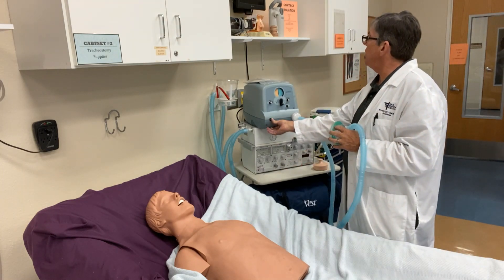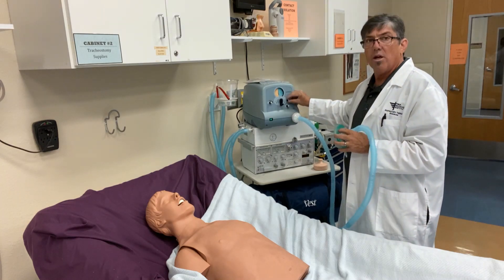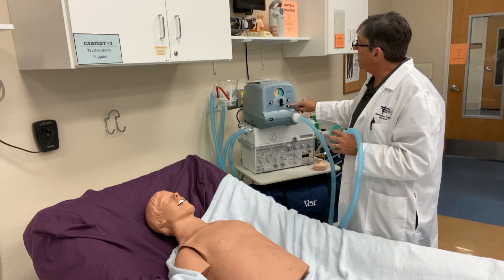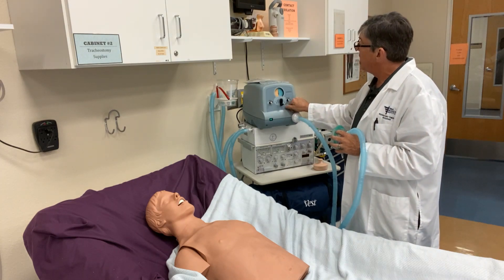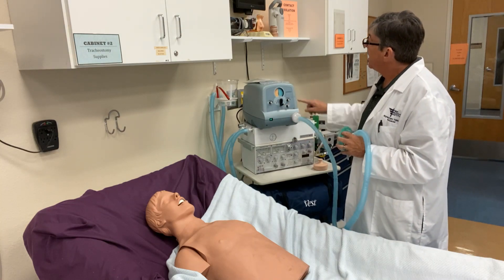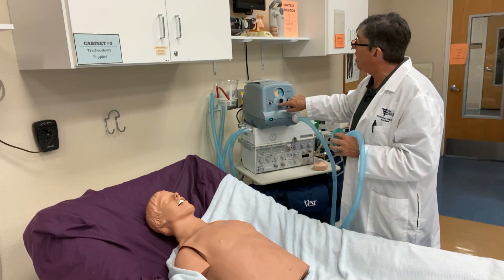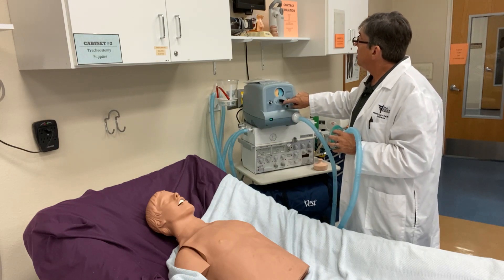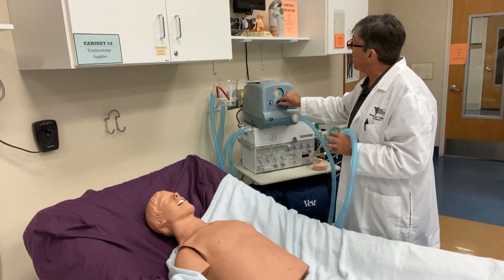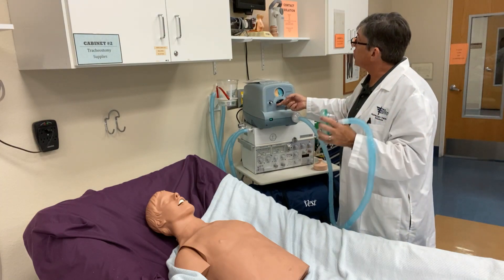We're going to turn the cough assist on. I've got the inspiratory pressure set at about the midpoint, so we're not starting too high. On the exhalation side I have it about at minimum as well. You also have an inhale flow control, so you can adjust the flow to a high flow or a low flow — there are some custom settings. I'm going to start on the high flow setting. This switch here is the manual control where you can select inspiratory, so when the patient inhales you give them this breath. That's set at about 10 centimeters of water. And when the patient exhales, we go to exhale — that's a vacuum or negative pressure to help have the patient cough and draw secretions out.